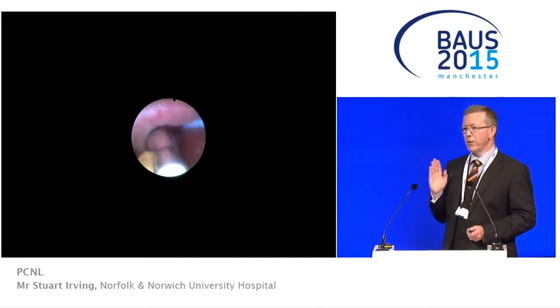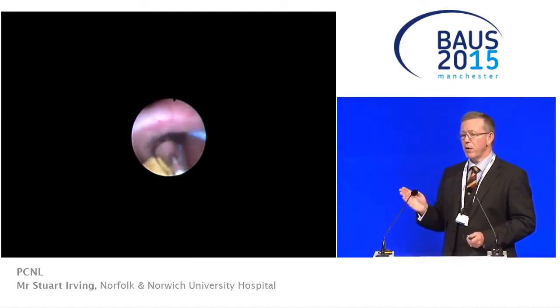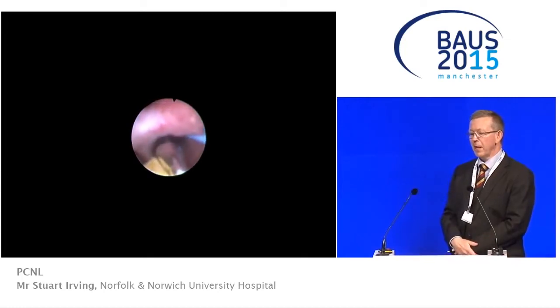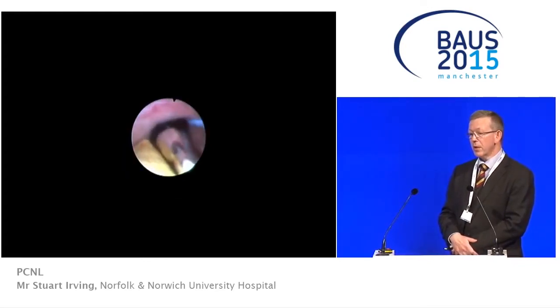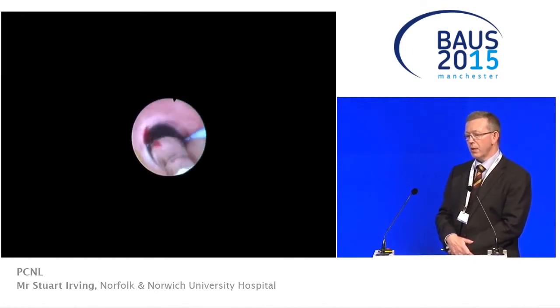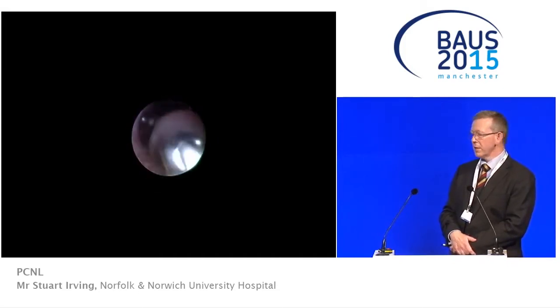But by having a wire in the sheath, sometimes we found it can impede movement of the scope, and what we worry about is damaging the scope on the side of the wire. So we elected not to do that in this case. And for that, it really depends on the size of the sheath and the size of the scope. So if one has a smaller Olympus P6, for example, typically there is enough room beside the wire. With the Storz, it's tight.